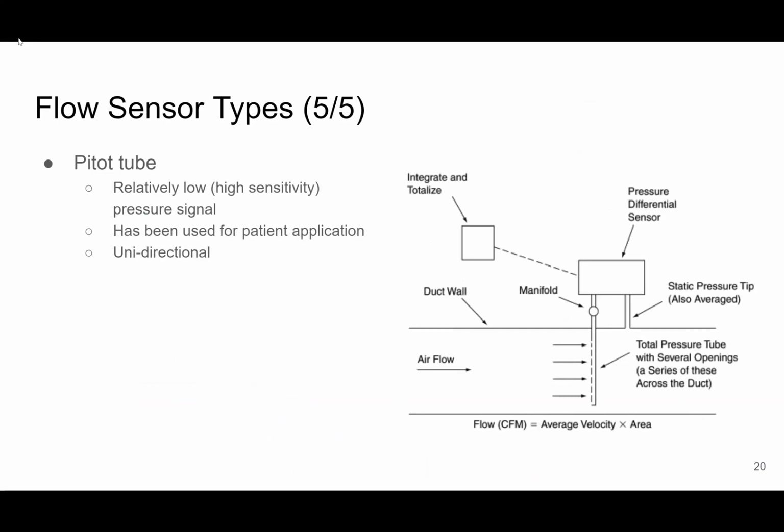So then the last that we haven't really looked at in this project, but we have used a fair bit before kind of in our other engineering projects, is a pitot sensor and constrained flow. They tend to, at least I haven't actually done a mathematical comparison of all of the different options here, but have pretty small signals in general for the flow rates we're talking about, and kind of have a more involved construction design, trying to get that measurement without wall effects and things like that in the flow.